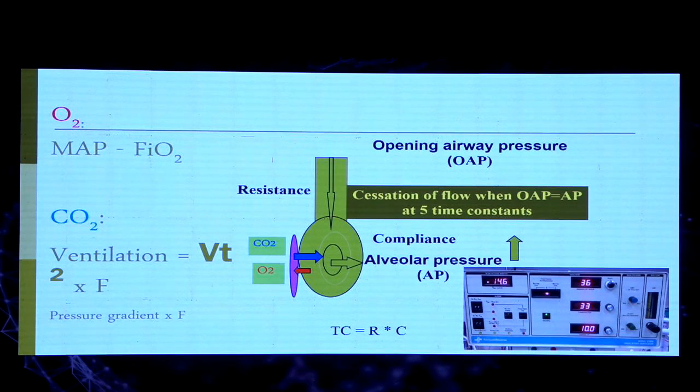complete an inspiratory expiratory phase, and therefore we do not complete those phases, and the tidal volume would be critically affected whenever you increase the frequency, because the times are shorter and you affect the tidal volume. And that's how whenever you increase the frequency, your carbon dioxide accumulates more.